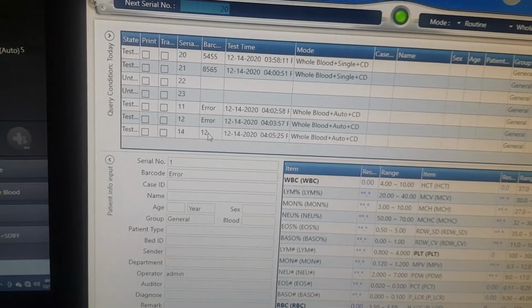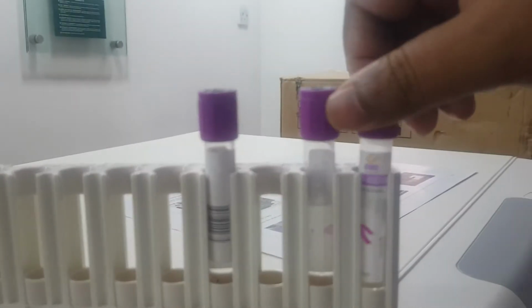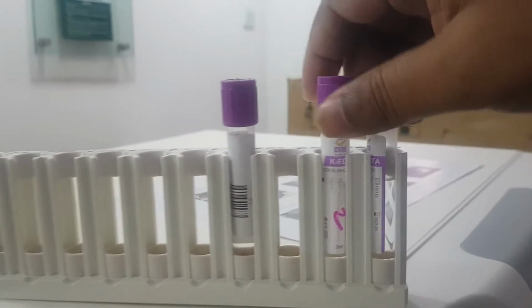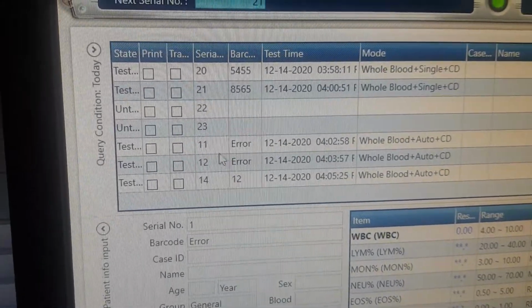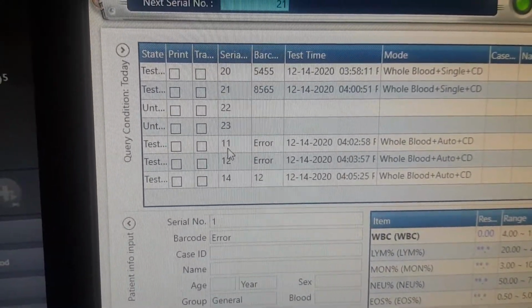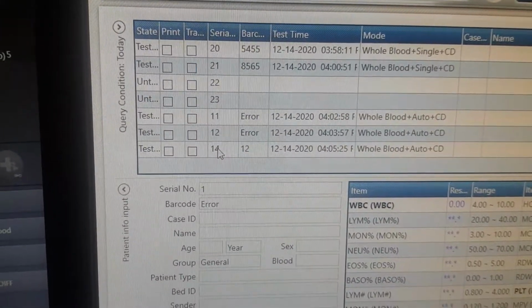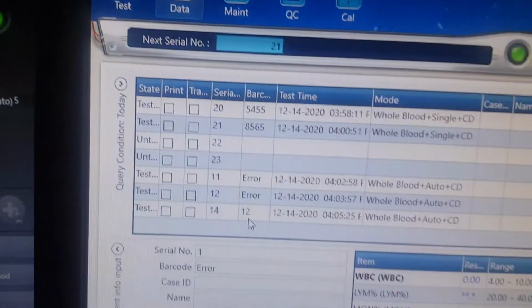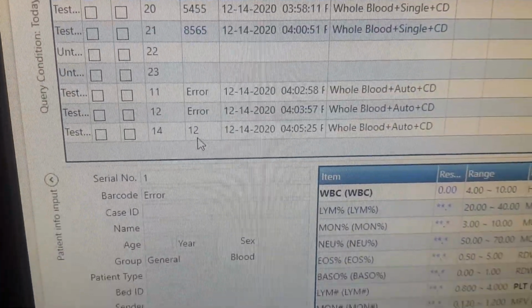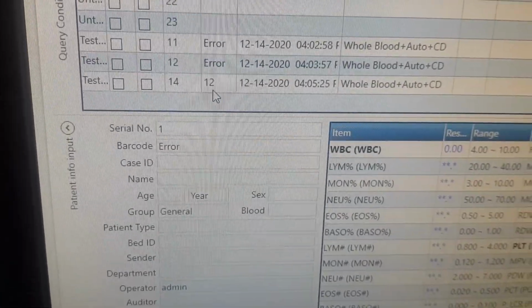So we have barcode, actually we have barcode in the tube, and this two tube we don't have any barcode. So those shows as error. So there is no barcode. But the position is 11. That means this is the second rack. In position 1, in position 2 and position 3 is empty, and position 4 there is a tube with a barcode. So this is how we can distinguish the samples. This is how we can find the sample as well as corresponding results.